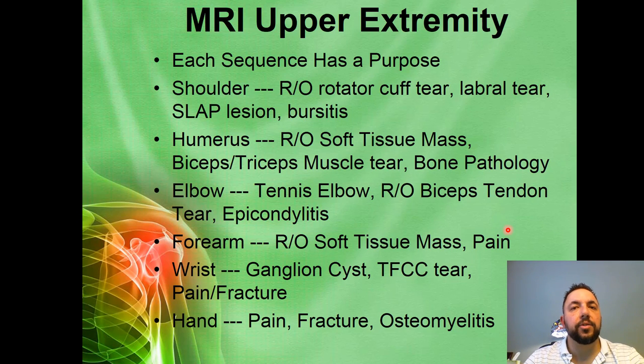And when we talk about patient imaging, we're talking about the fact that each sequence has its own purpose. Obviously, we know from the building blocks of what we've been discussing, T1 is our basic anatomy scan. We always run T2 as our basic pathology scan. And there's a mixture of scan planes that are appropriate based on body part, based on anatomy.